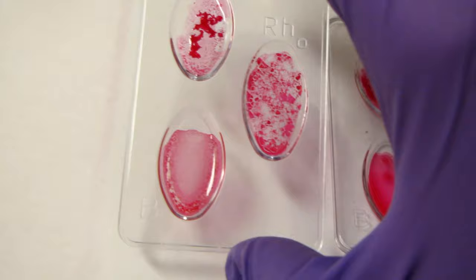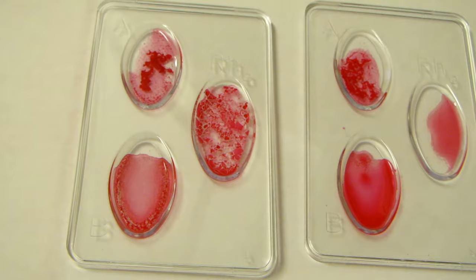And finally, comparing these two, we have the opposite of the last ones — we have A positive and A negative. Those are all the different blood types — hope you enjoyed that!